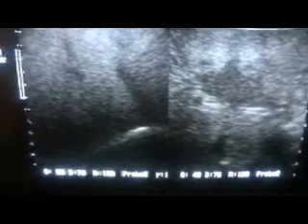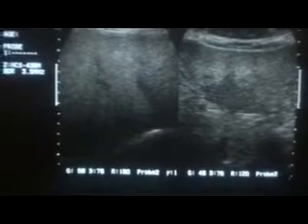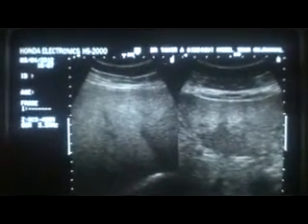So now let's move on to another segment that will again explain a bit. Let me tell you how a normal liver will look. You should know that rather. So let's go further and study the same segment. Now this is again the same segment. This area is the same segment of the left lobe of the liver. If you concentrate, this linear structure is the ligamentum venosum. This is the caudate lobe, and this is the IVC in transverse section. So this is the area under consideration.